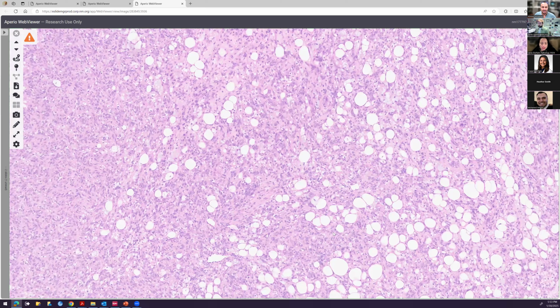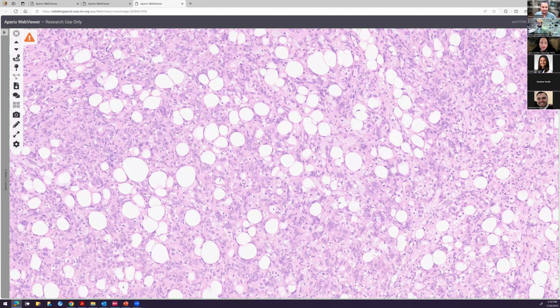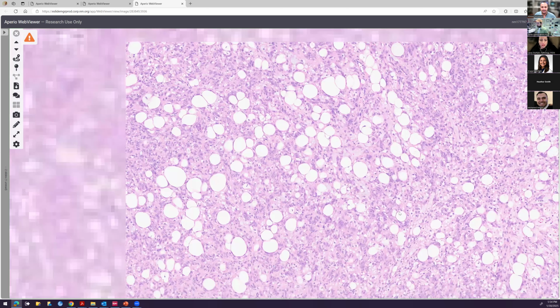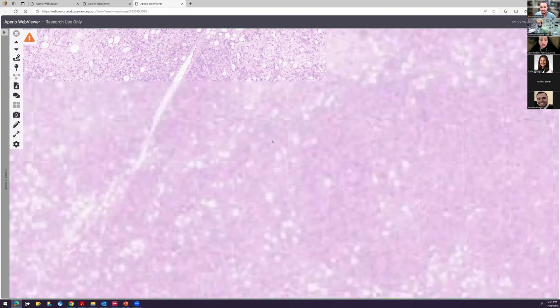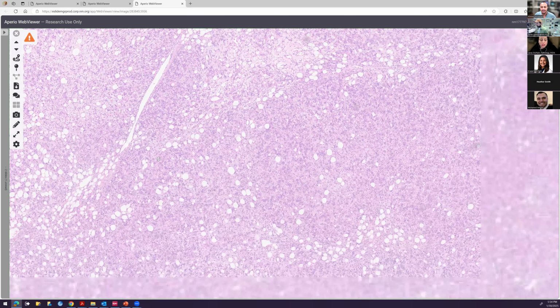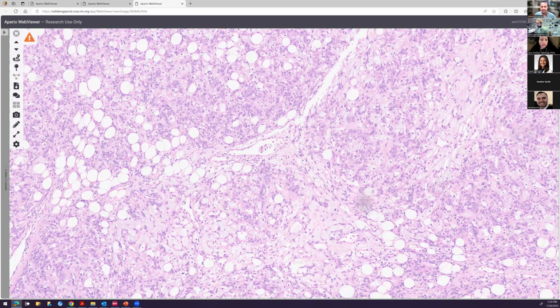You really don't want to neglect thinking about it. In a tumor where you might be wondering if it could be some sort of spindle cell or pleomorphic lipomatous tumor, think about getting STAT6. This one didn't even really have the best staghorn vessels, but there are some here where you can see this branching.